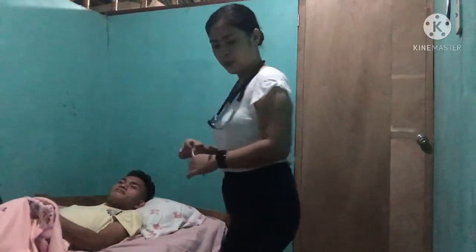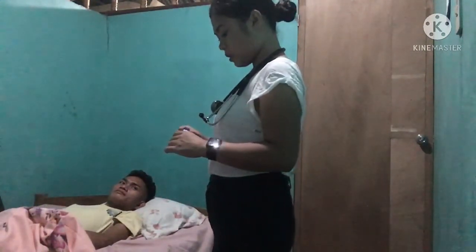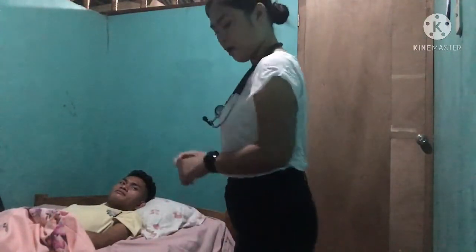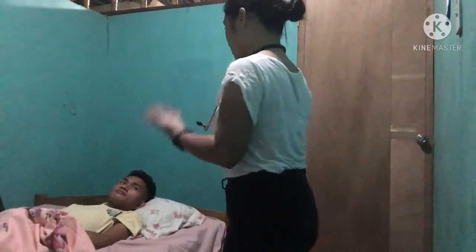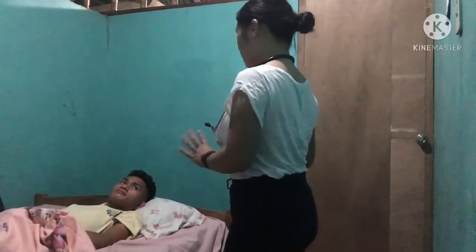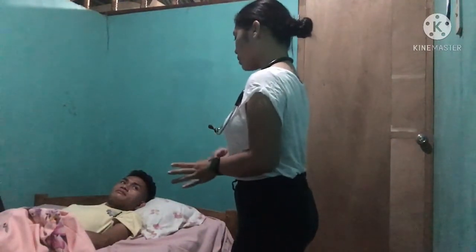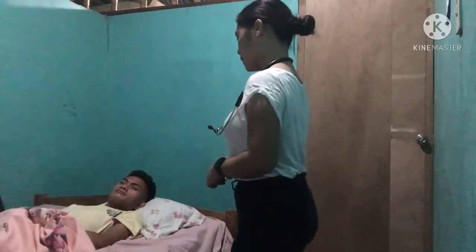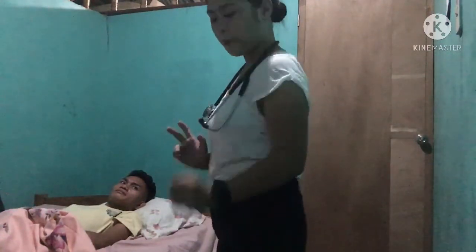Okay, so your temperature, sir, is normal. It's 36.7. Don't worry about that. And your pulse rate is 69 beats per minute, and your RR is 16 breaths per minute. Okay. So now I'm going to take your blood pressure.